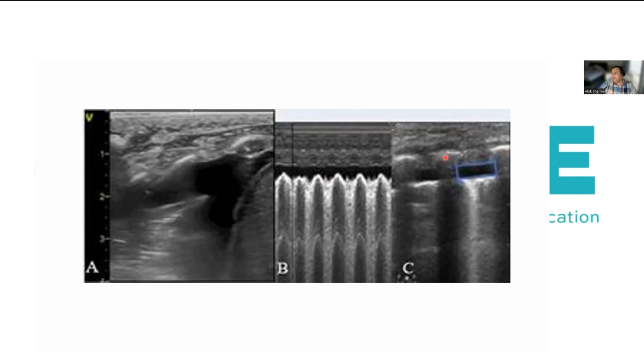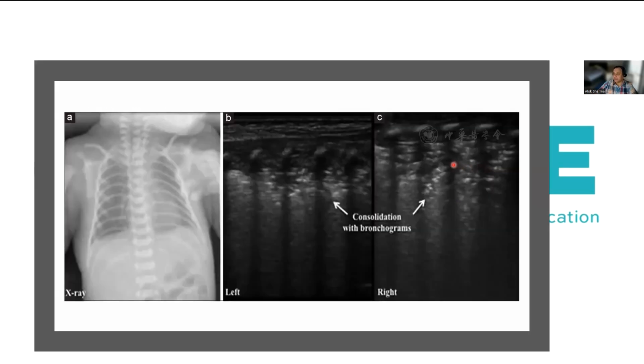You can see the ribs over here giving their rib shadows with the lung that is visible over here. Now, for those of you who've never done lung ultrasound, take my word for it that you can see what is an A profile, which is well-aerated lung, with these vertical lines, which we call B lines. So what you've got is basically an AB profile. And this is, in essence, a baby who's got transitioning lung, most probably, with a small effusion in between the ribs. It's not massive. And this quadrilateral, my apologies, rectangle that you see is what we know as a quad sign. And I will explain what it is.